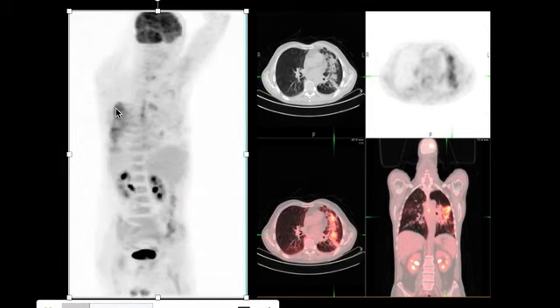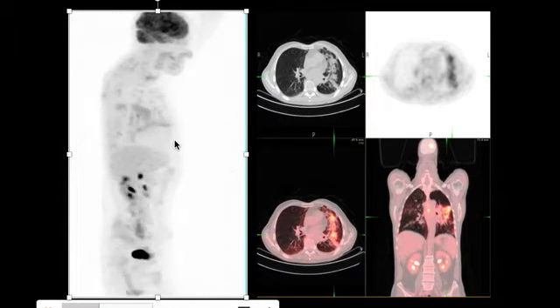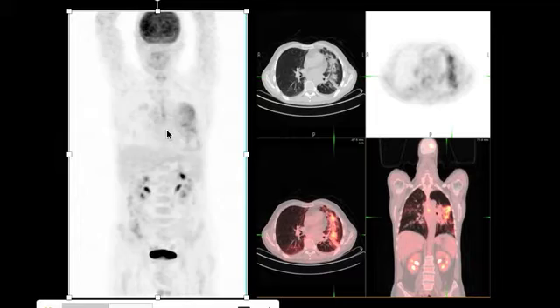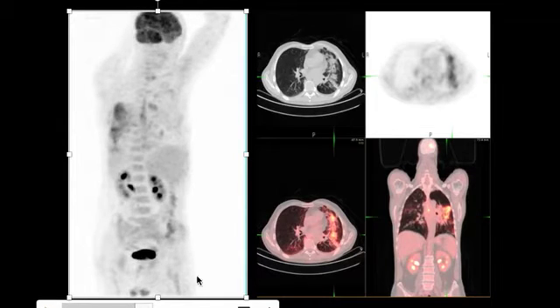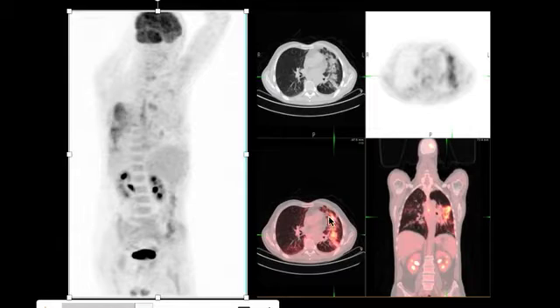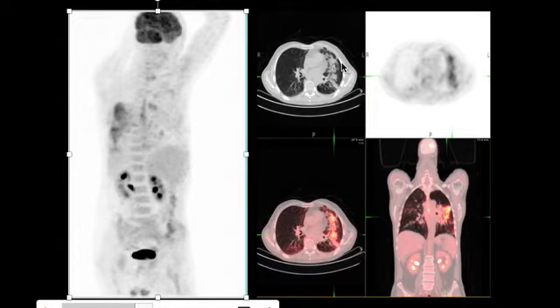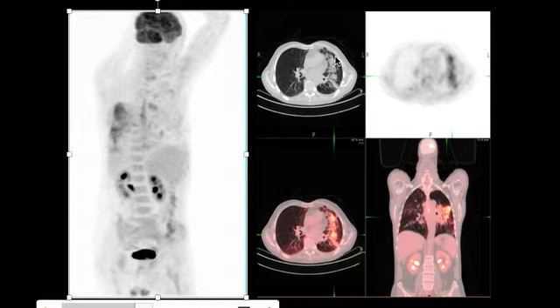On this study we see this large area of hypermetabolism in the left lung, and this corresponds to multifocal consolidation and heterogeneous hypermetabolism seen on this fused axial PET-CT image. Notice however that the consolidation has a linear edge, and this is characteristic of the radiation port, so this finding suggests radiation pneumonitis.